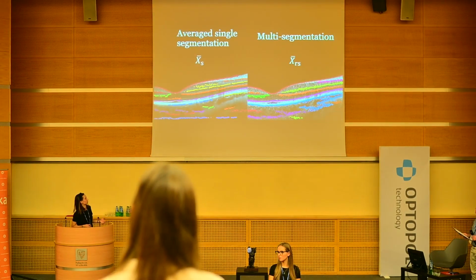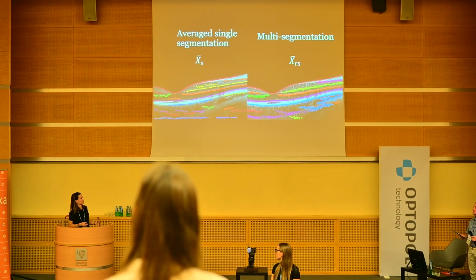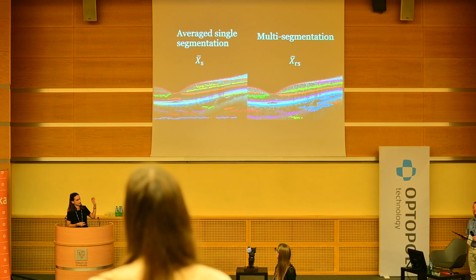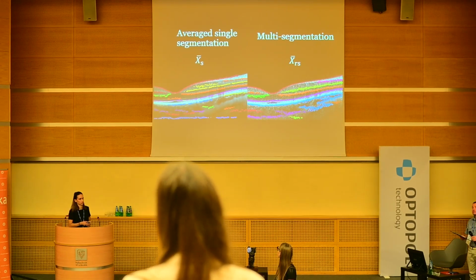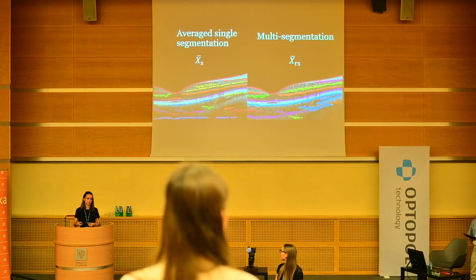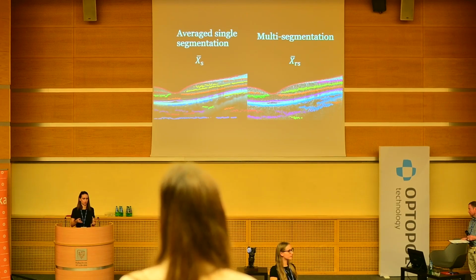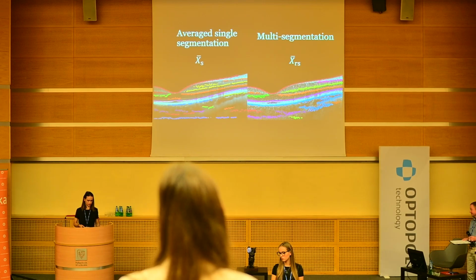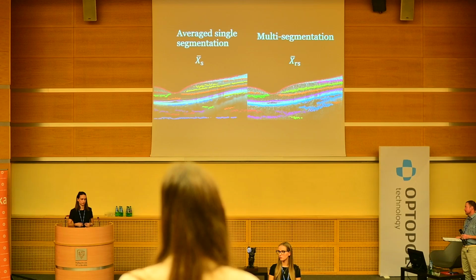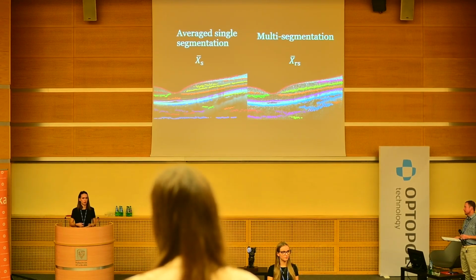Maybe you can see the differences in the quality of those two scans. The average scan is quite blurred compared to the non-averaged approach, and that's why we aimed to perform a method that would give information from more raw data, I would say. Also we compared the methods with other algorithms like Cassini, like OCTRIMA, etc.